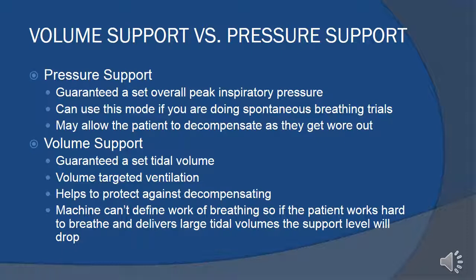Now in volume support, you're guaranteed a set tidal volume. You get volume targeted ventilation. And it helps to protect against decompensating. Why is that? Because now if the patient starts to wear out and the tidal volumes start to drop, the machine will immediately start to increase the pressure support to meet those increased demands from the patient. However, since we're not adjusting the pressure support, the machine is, we might not notice subtle changes in that support level, thus alerting us to the fact that they are getting tired. So you have to pay very close attention to your trending peak pressures.